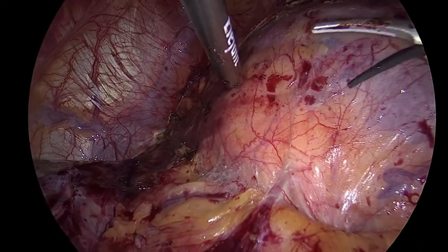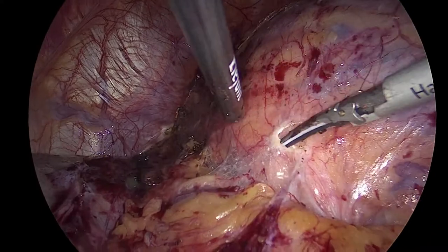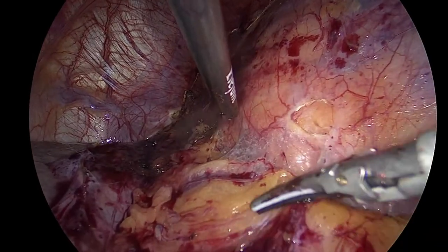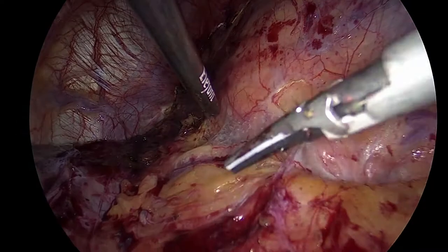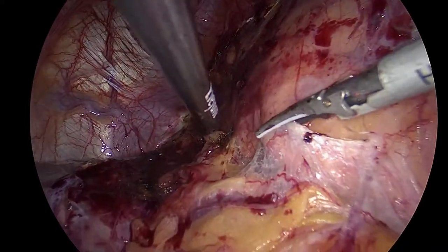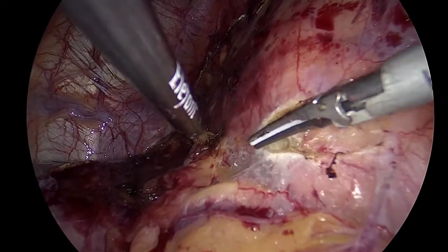Now, I could go directly to the tumor, but I don't want to. I want to find everything nicely here, dissect. Now, this is transperitoneal fat. This is the Gerota's fascia. Sometimes the superior mesenteric artery comes here and buckles up, does a bending here, and this is one of the worst complications that you can have. I mean, ligate the superior mesenteric artery. Terrible. Disaster. Well, it happens. It has happened.